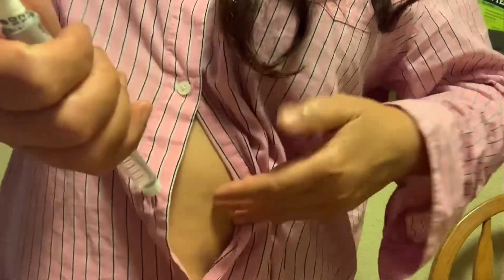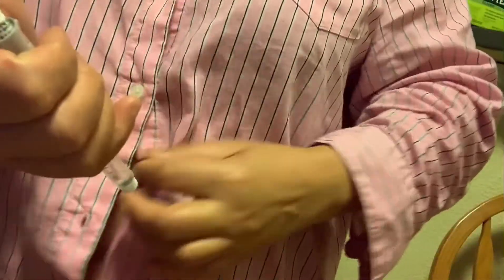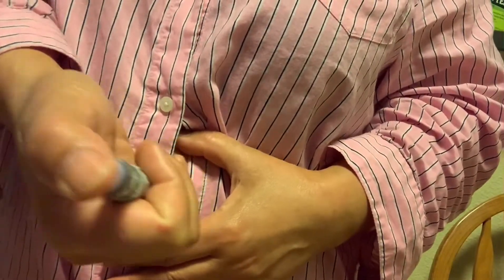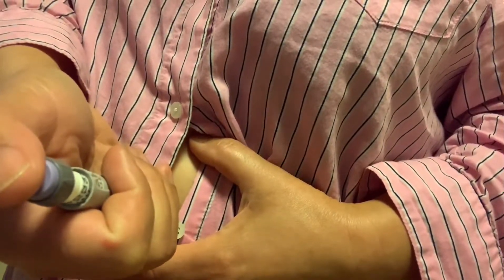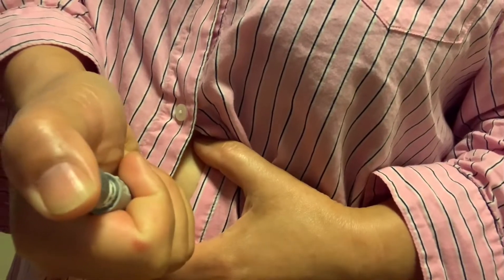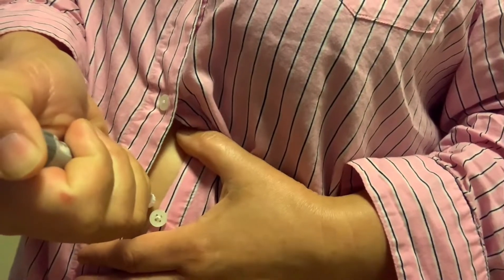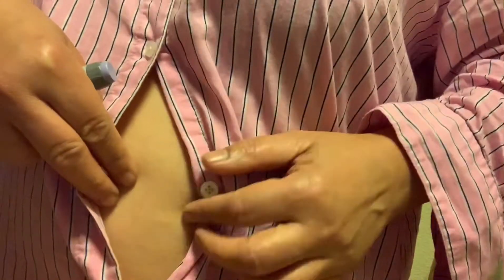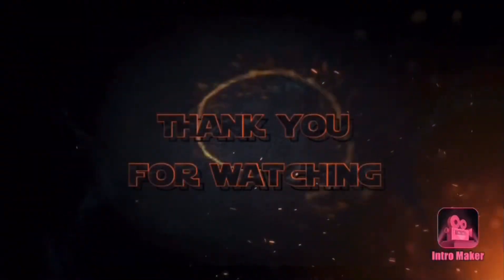I'm going to do the insulin injection on the other side because I already have holes on one side — my stomach is full of holes already from injections. I'll find a good spot for every night. Done — thank you!